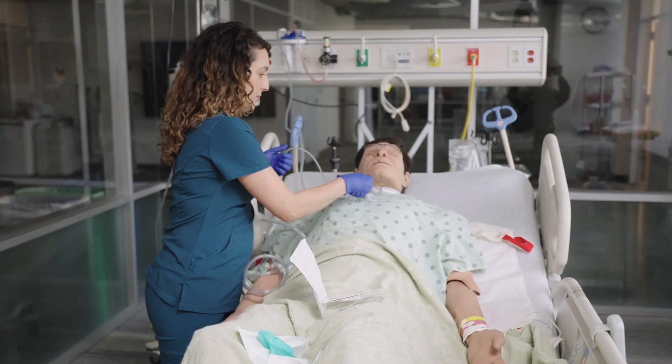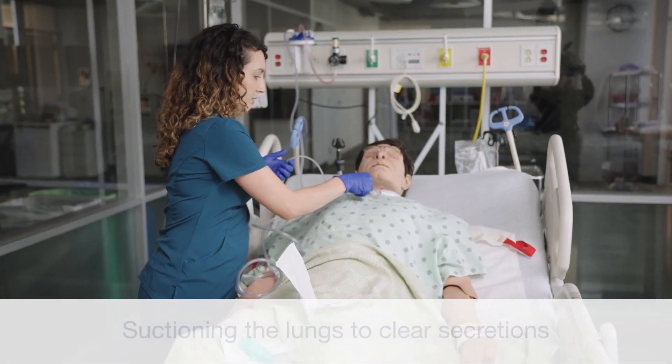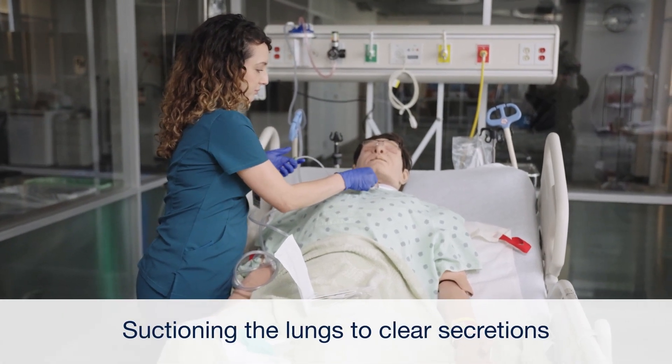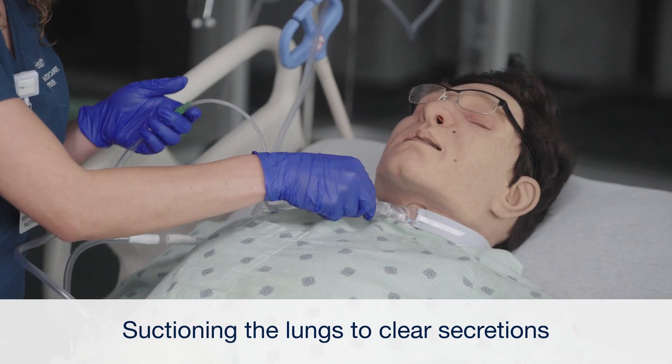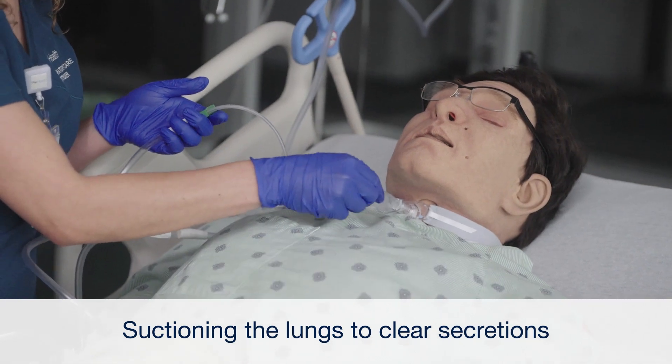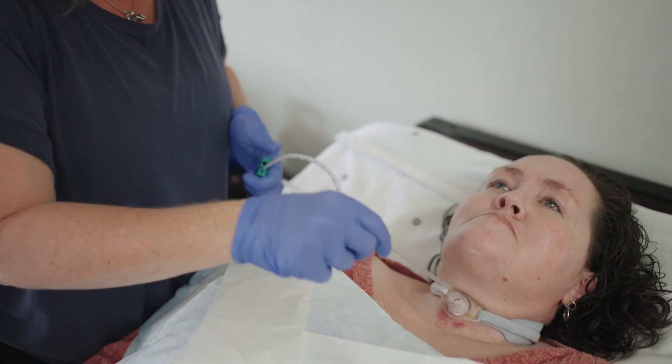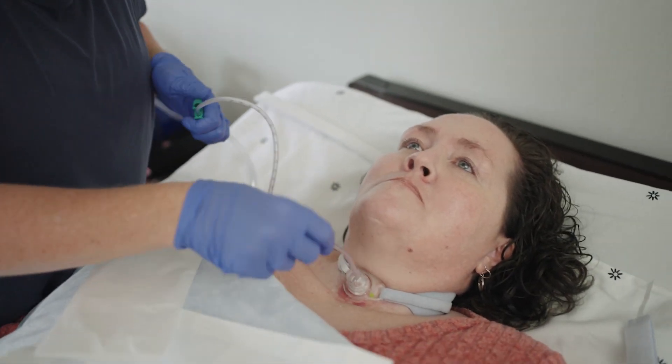Some people are at risk for pneumonia because they cannot prevent saliva from getting into their lungs. For these patients, the purpose of a tracheostomy is to allow caregivers to suction the lungs clear of those secretions. The trach doesn't prevent saliva from going down into the lungs, but the ability to suction the lungs through the trach reduces the risk of pneumonia for these patients.